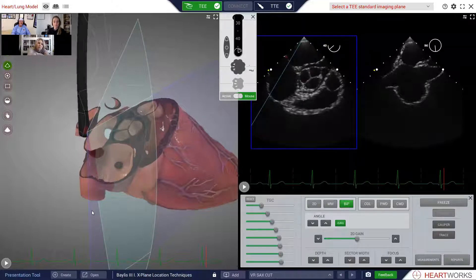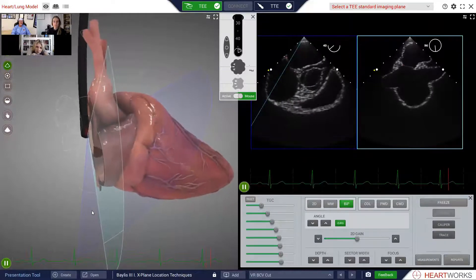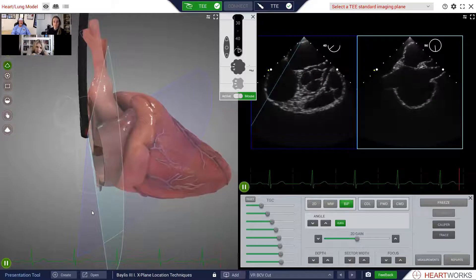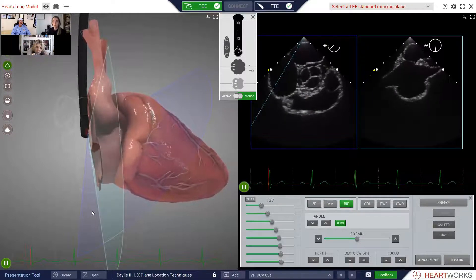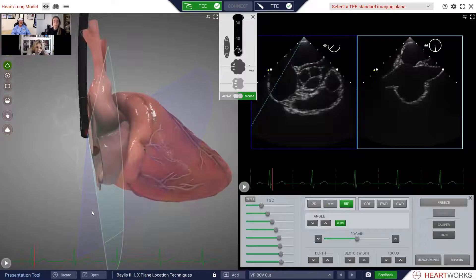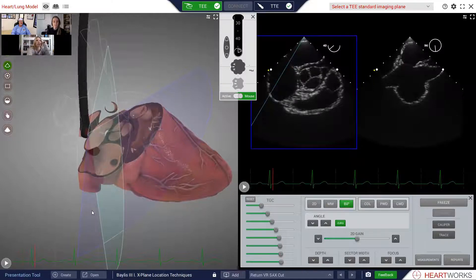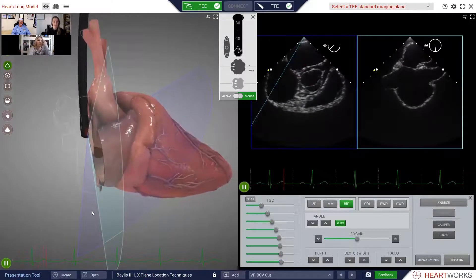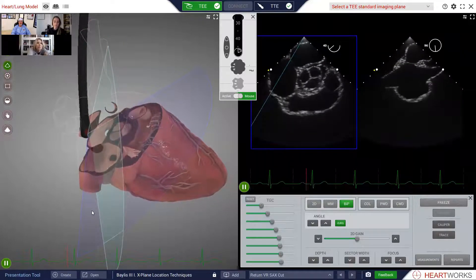Now let me show you if we cut into the heart using the plane that's generating the secondary plane, which is the bicaval plane. Now back to short axis — let me just do that again. Here's the bicaval cut, and here's the short axis cut.